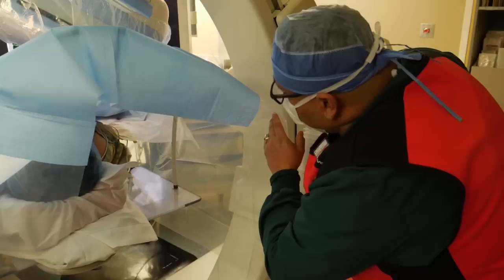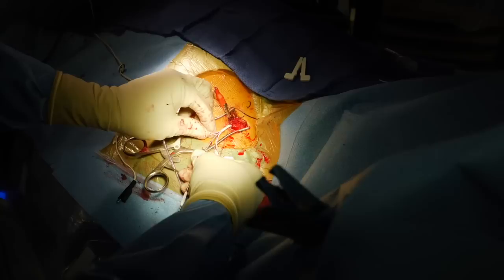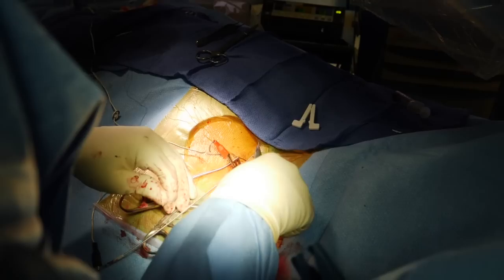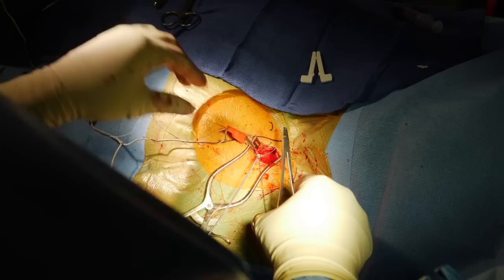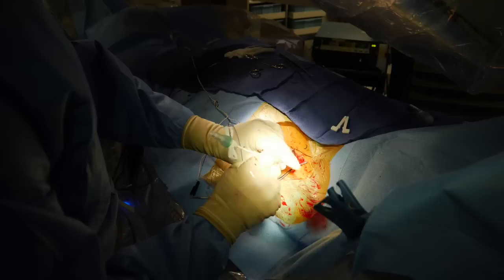Our nurse attends to the patient, takes care of all their needs, makes sure they're completely comfortable. There we are removing that outer sheath — it's a breakable sheath that we peel away to take it off the lead, removing it entirely from the body. We anchor the lead to the chest muscle directly, securing it firmly so it cannot move and matures exactly in that spot, using a non-resorbable suture. There's our pacing lead beautifully moving with the motion of the heart at the top of the heart, engaging the conduction system directly.